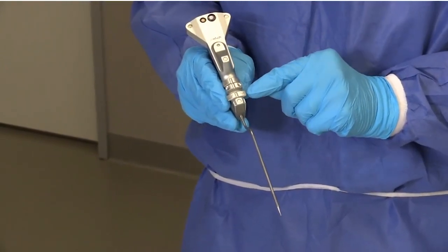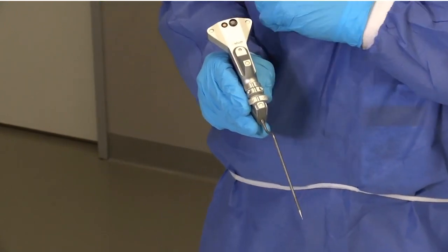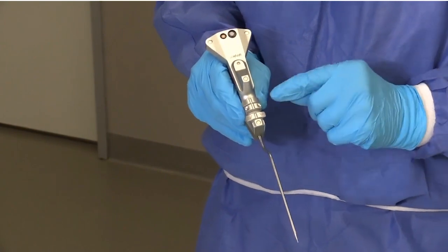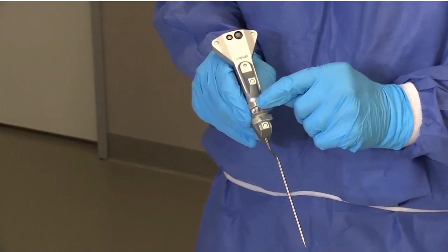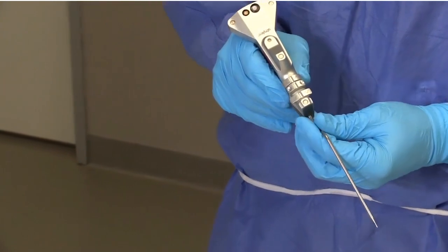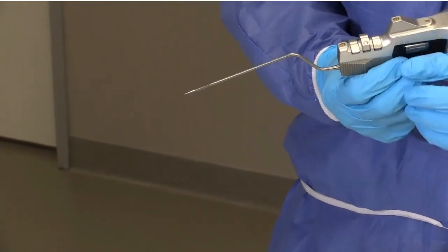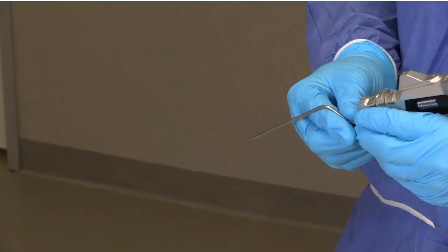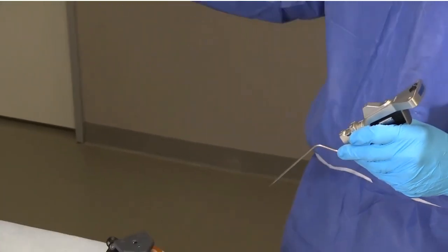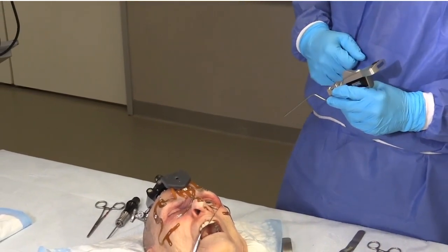On the sides at top and bottom, you have up and down arrows to move the cursor around the screen. The middle button that stands up is like the click button on your mouse, allowing you to click an action point on the screen. To do our registration, I point this and hit register, and now using the LEDs it's going to match the two data sets together.